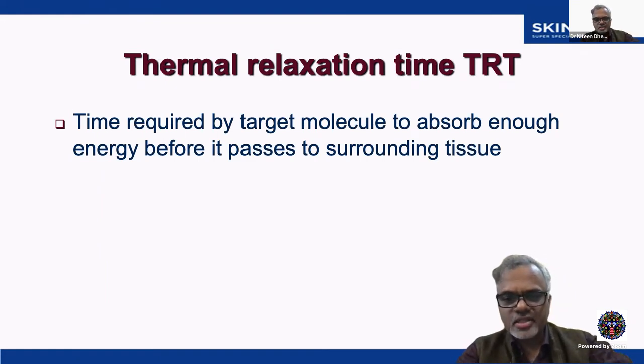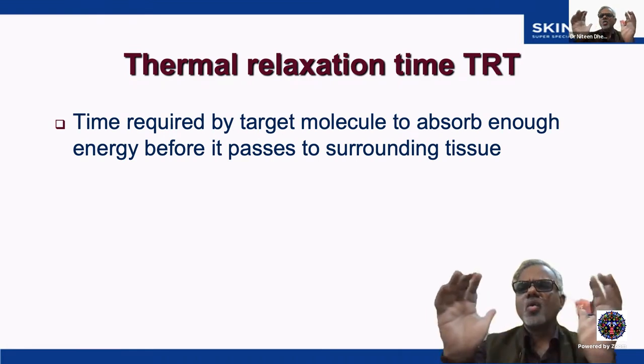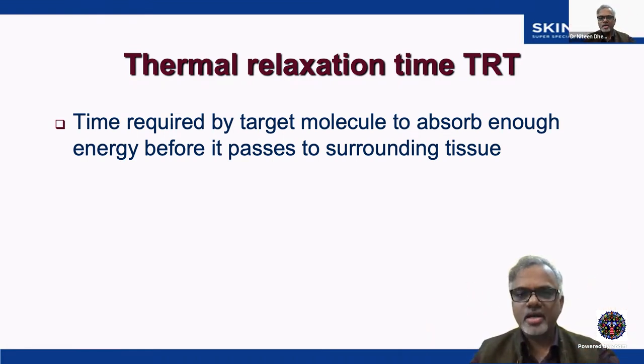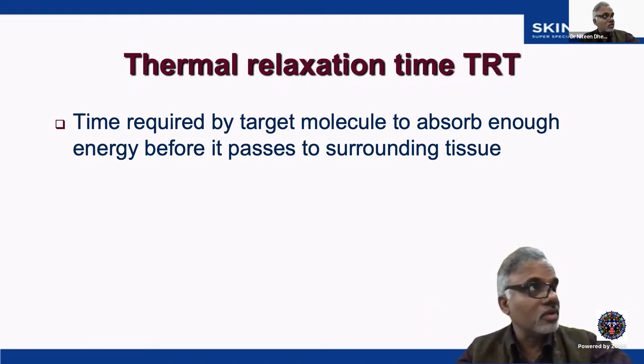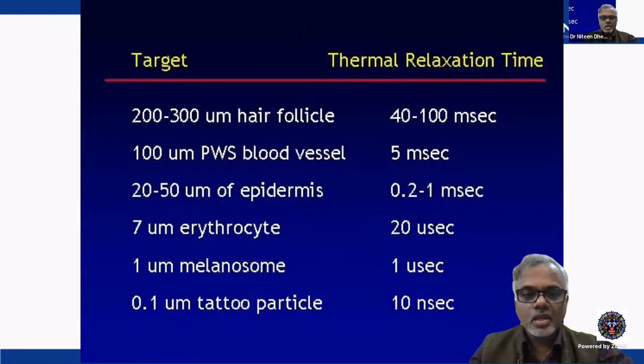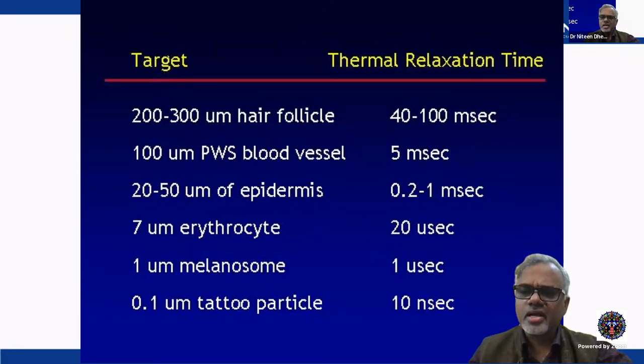So there is a concept of thermal relaxation time: the time required by the target molecule to absorb enough energy before it passes heat to the surrounding tissue. The thicker the target, the longer it takes to heat, because the heating time depends upon the volume of the target molecule or tissue. It changes with the square of the diameter of the target. So the thicker the target, the longer you need to hit to destroy it.